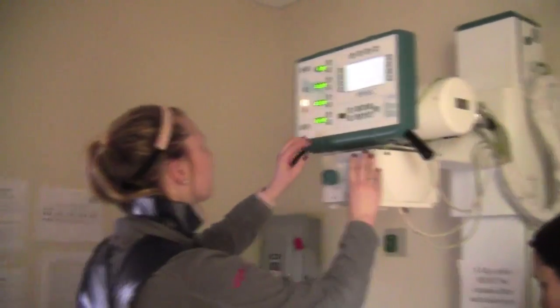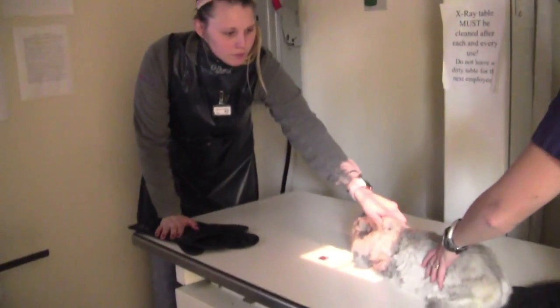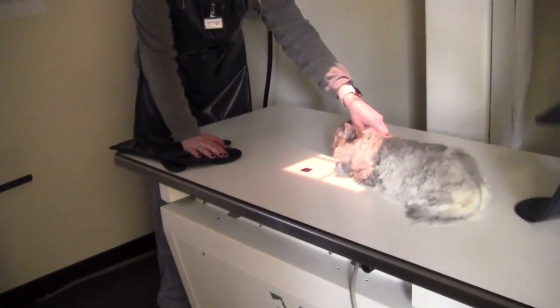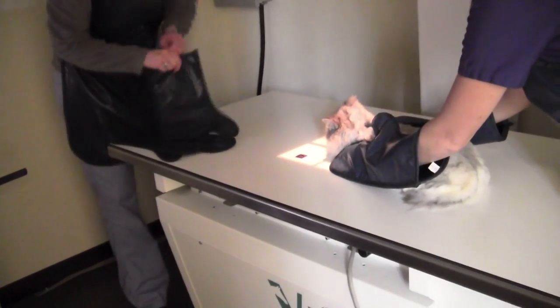Once I have entered the kVp and mAs based on the technique chart from my measurement, I will place the patient in dorsal recumbency with forelimbs extended cranially, with nose between the forelimbs and hind limbs extended caudally.